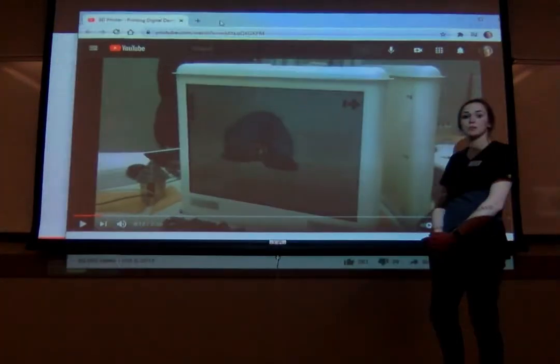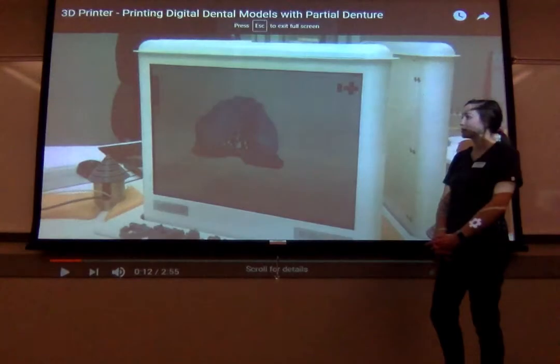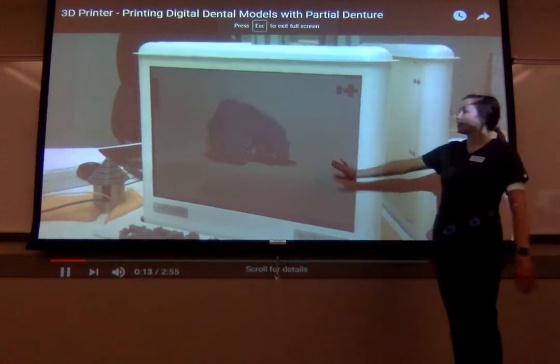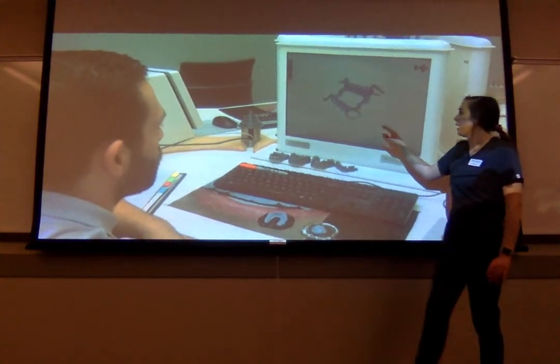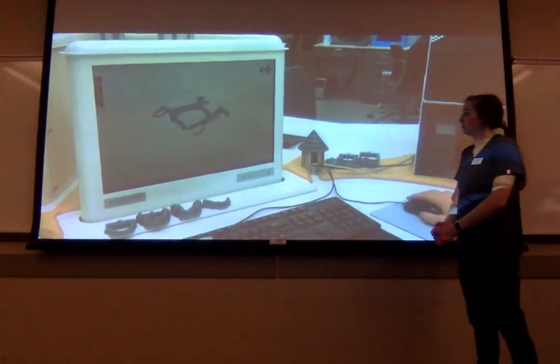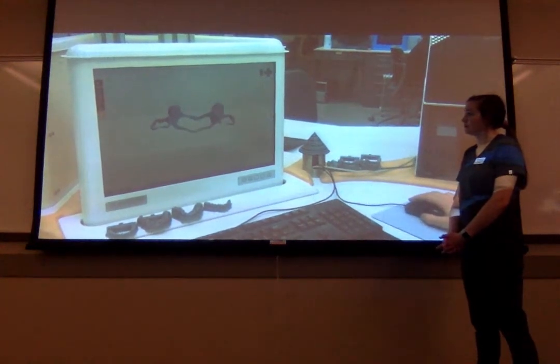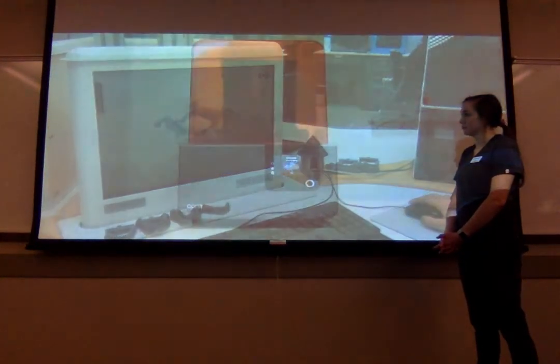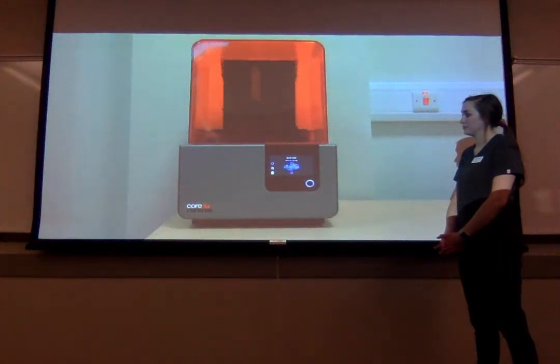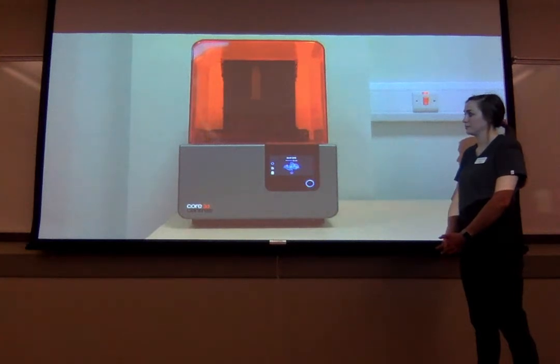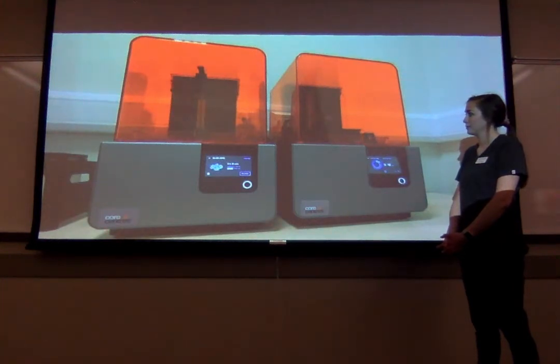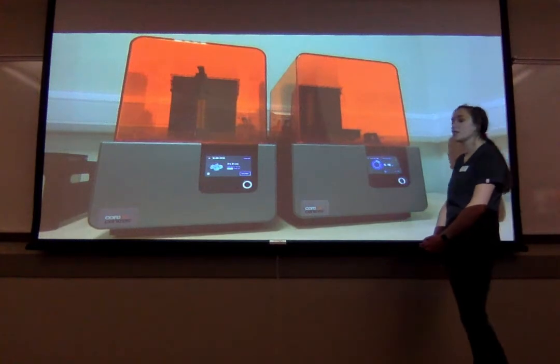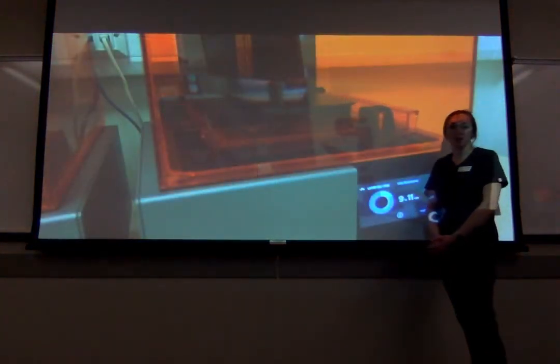So this is just a short video showing you guys in a few simple steps how 3D printing works. This video starts after the initial scan has already been taken with the intraoral scanner, and that is them in the lab designing what they want to be printed. And then here is just showing the 3D printer printing the study model and the appliance.